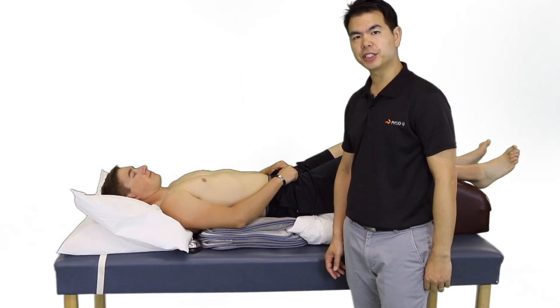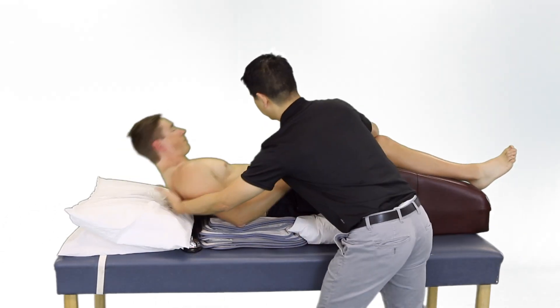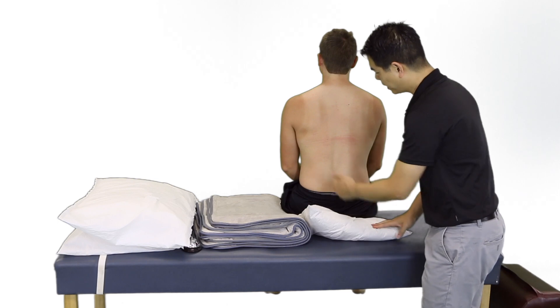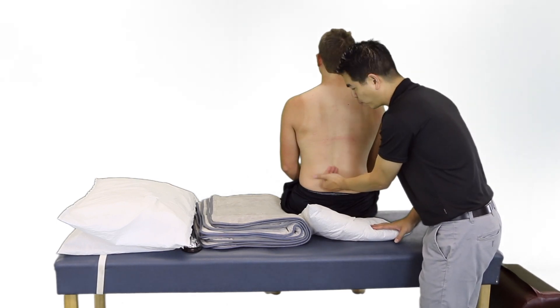After the 20-minute session, I'll help the patient get up from the table. It's important to assess the tissue — it is normal to see a little bit of pink, redness, and some warmth.